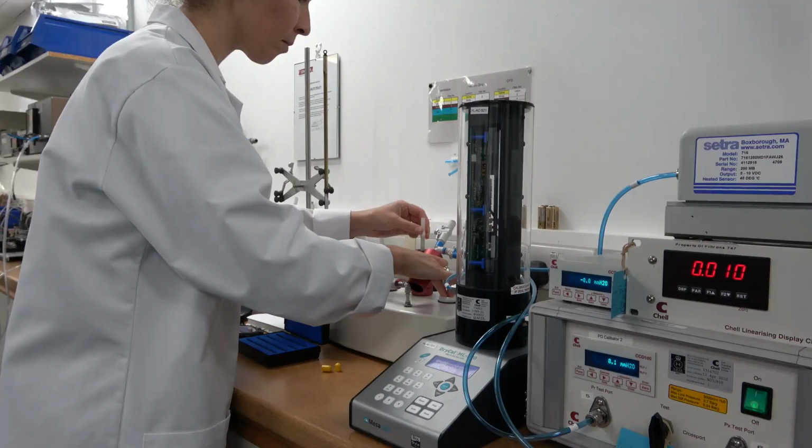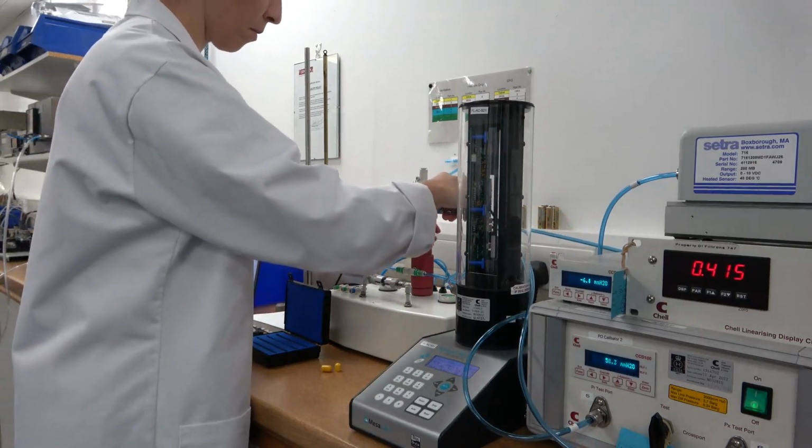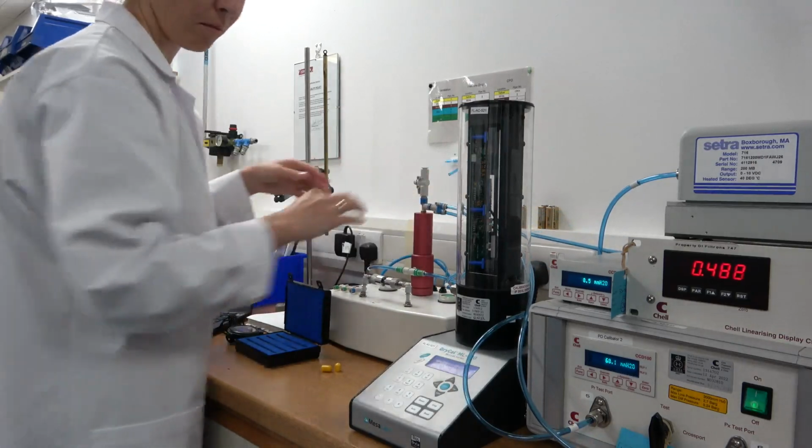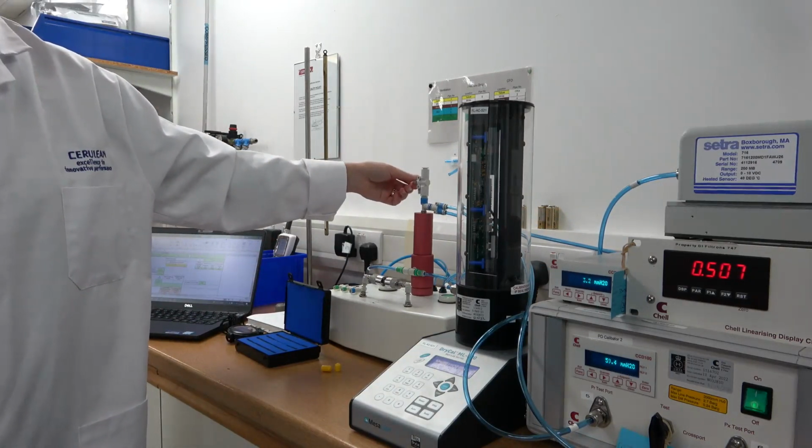PD and ventilation calibration standards, being made of glass, are susceptible to damage by careless handling. In use, air is passed through the standards. Air from the surrounding atmosphere will almost certainly contain dust particles that will slowly contaminate the capillaries. Calibration standards should therefore be stored and handled with care to avoid damage or excessive contamination.